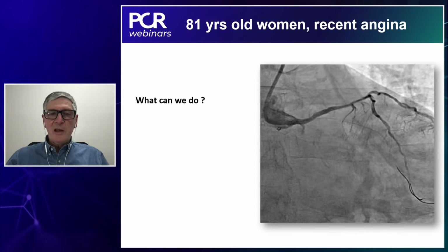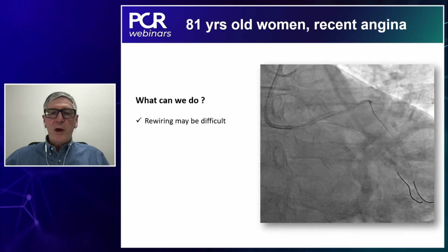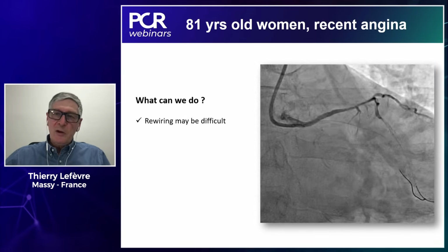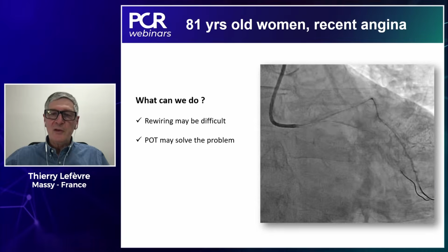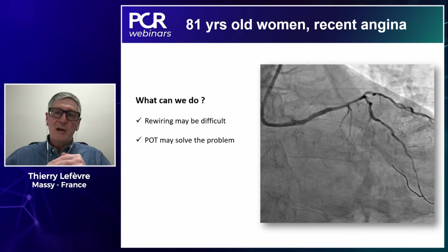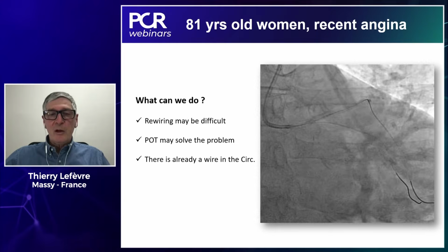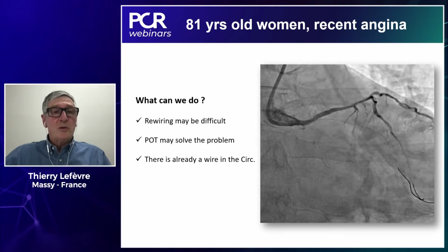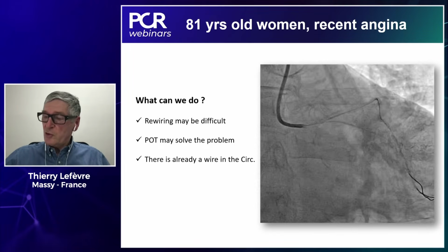Okay, so Jean, as you said, we can try to rewire, but in my opinion, as Goran said, it's not the first option because it will be very difficult, because you have really pushed the carina and it's closed. POT may solve the problem, and we'll see. And we have a wire in the circ, so we can use a wire to reopen the circ with a small balloon.